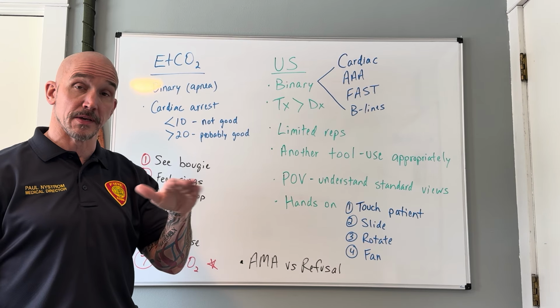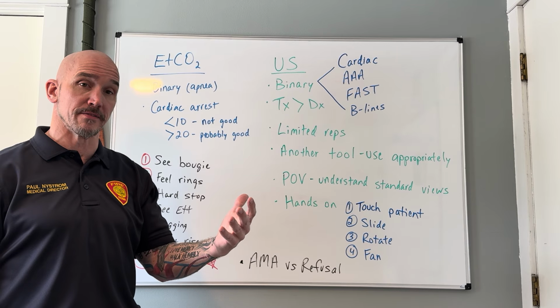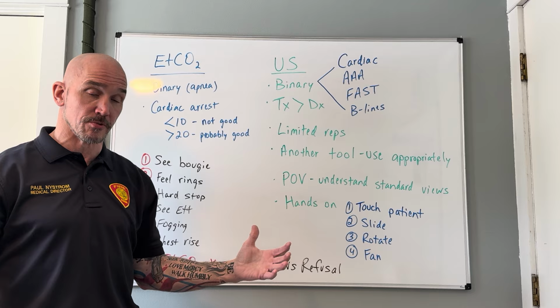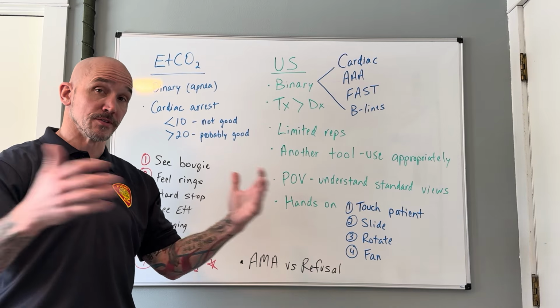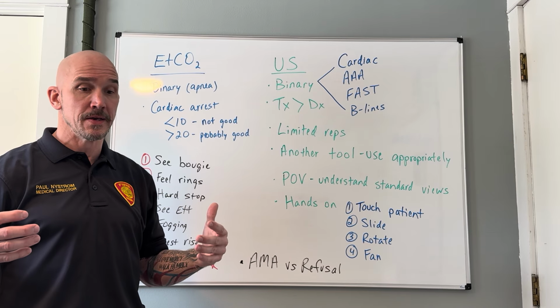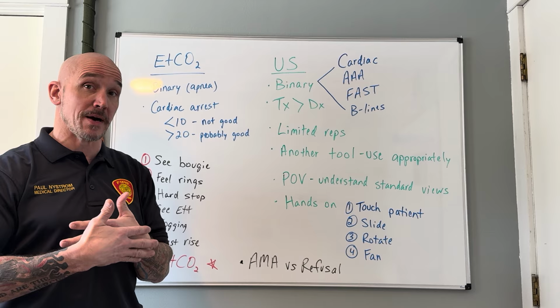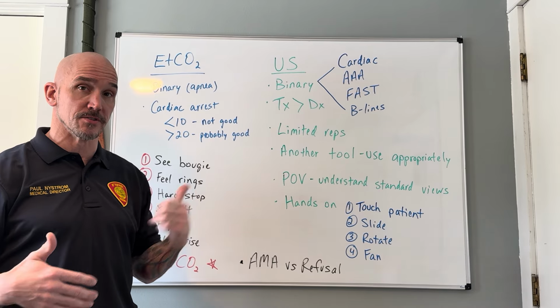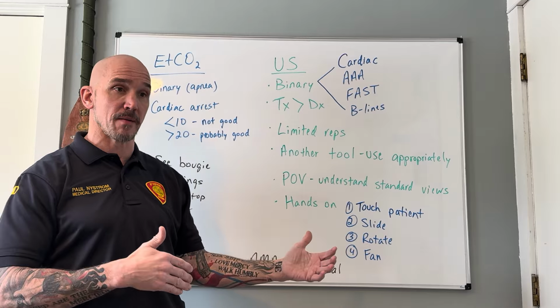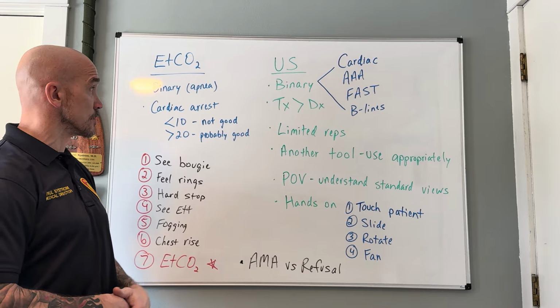But when they go apneic, with the end-tidal CO2 you will pick that up much sooner than somebody who becomes hypoxic. Right, so when we do a sedation in the ER, we have a face mask with oxygen on them to pre-oxygenate them because we have all the time in the world to do the sedation, but we're also prepping in case something goes bad with the airway, so we want lots of time, right? So they're on oxygen to wash out all the nitrogen so they hopefully don't get hypoxic. That's the whole goal. When we watch with end-tidal CO2, we will pick up that they stop breathing so we can do something about that prior to them getting hypoxic. Because once they're getting hypoxic, we're sort of already behind the curve. So we can pick that up much sooner.